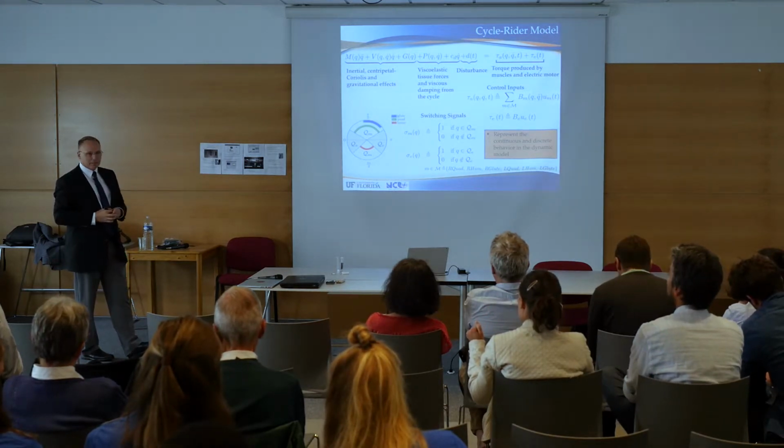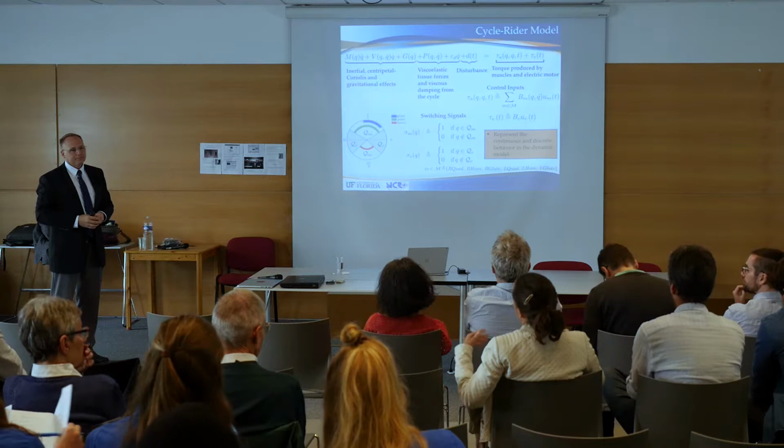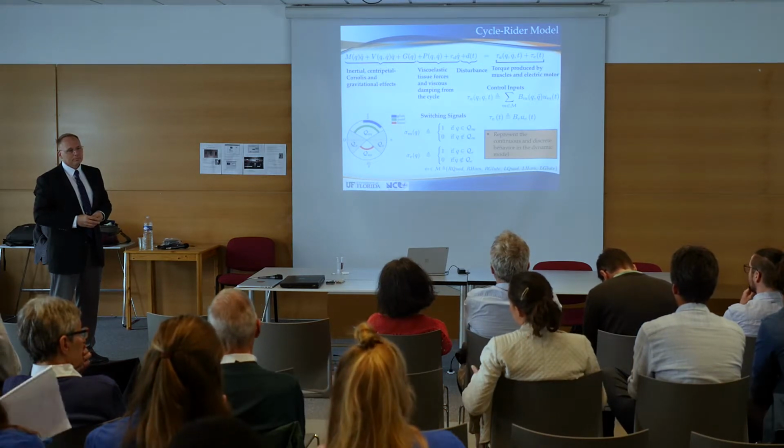Yeah, so there are two answers to that. You can do it experimentally, and we did, where we had healthy normals, and we measured the torque output at the different angles throughout the crank cycle, and then we could measure the torque effectiveness at those different regions, and then say, okay, well, this is a region where it's good to stimulate, or this is a region where you're not going to get as much output. You can also actually calculate the torque at given angles as well, and in fact that matched up with our experimental measurements.